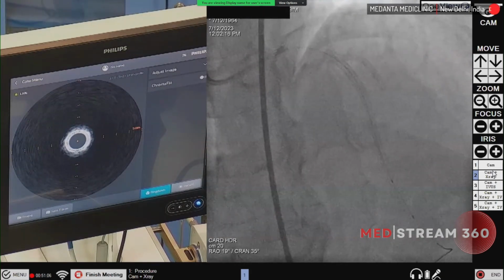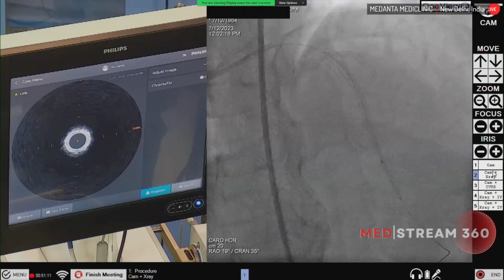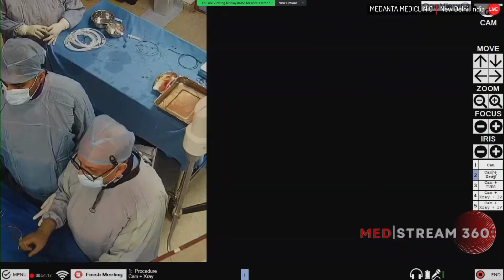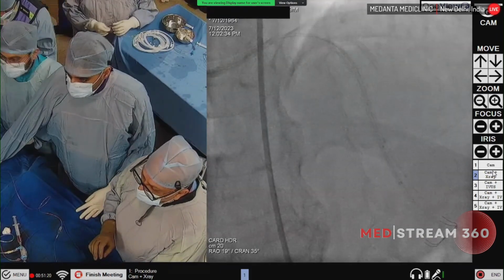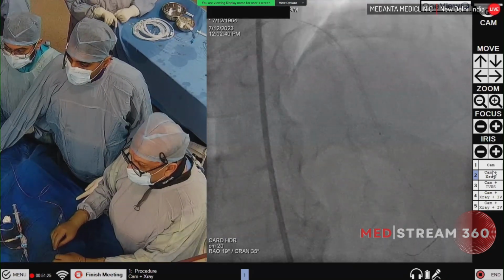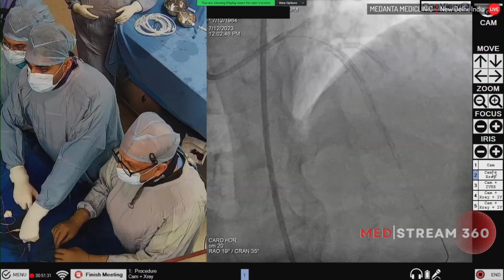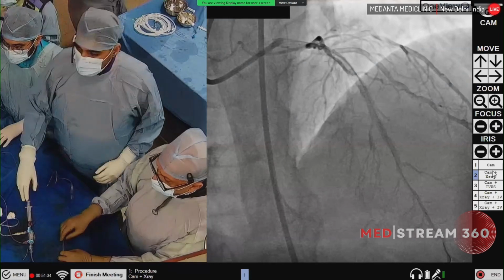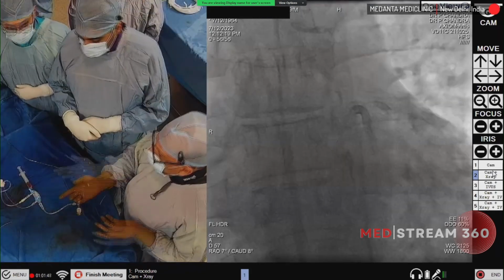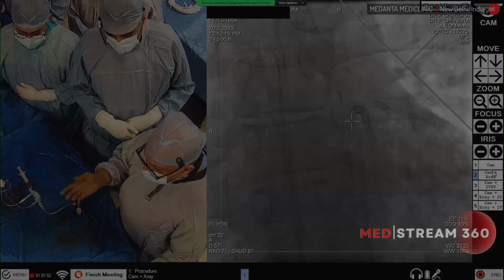Okay, go up. 1, 2, 3, 4, 5, 6, 7, 8, 9, 10, 12. 12. 14. Okay. Keep it. Okay. Deflate. Check, please. This looks very nice, actually. So I think I have nothing more to do. So we checked in 2 views. Everything is okay. We can stop. So with this, I think we can stop here. Thank you very much.